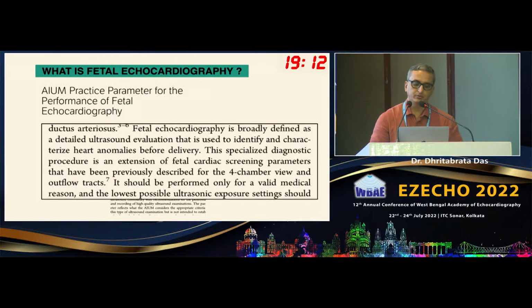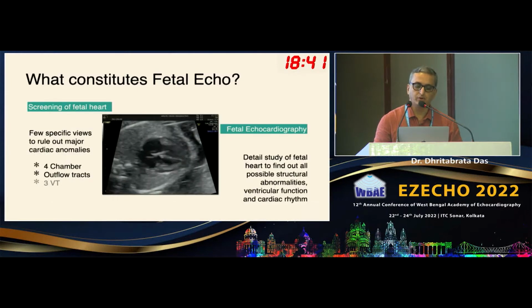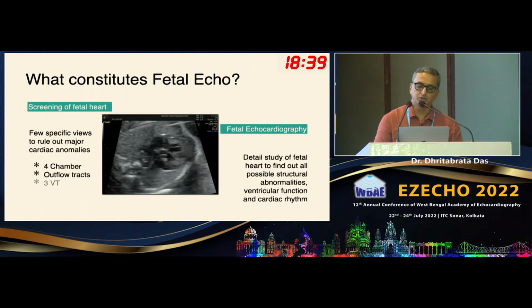Now let us start with what is fetal echocardiography. We know that it is defined as a detailed ultrasound evaluation, a specialized diagnostic procedure and an extension of the fetal cardiac screening parameters. It is very important to understand the two terminologies. One is fetal cardiac screening, which is mostly based on the 4-chamber view and the outflow tract views, and the other is fetal echocardiography. So we have to be very sure about the differences between these two terminologies.